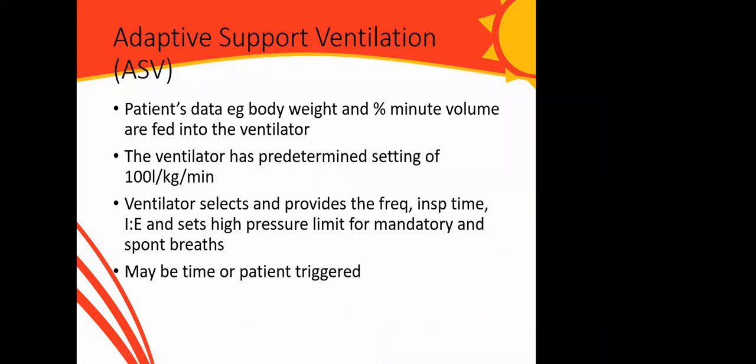Some ventilators, I've worked with some ventilators, and in your setting, you need to be familiar with the kind of modes that are available in your ventilator. Well, we have what we call the adaptive support ventilation. I remember there was this ventilator I worked with in Shell, Port Harcourt, those days. They have this mode, a beautiful mode, adaptive support ventilation. What it does is that you feed in patient parameters, like the weight of the patient, 75 kg, and you calculate the percentage minute volume you want to deliver, and you enter these parameters into the ventilator.